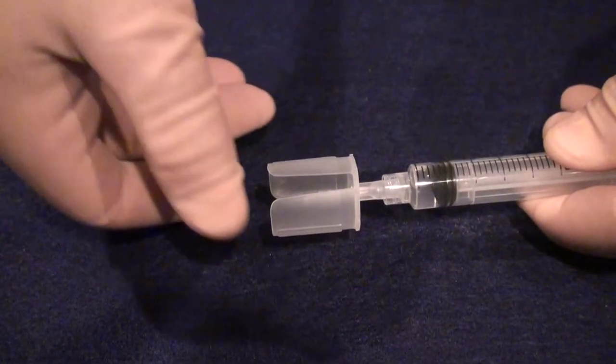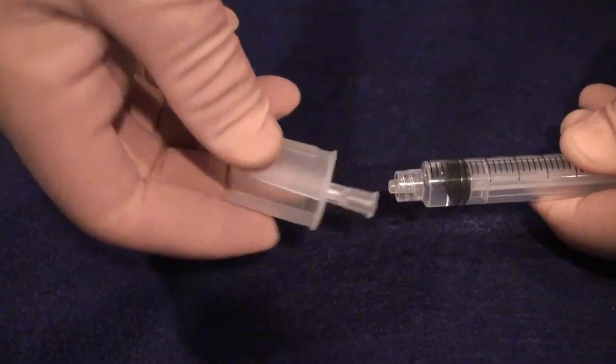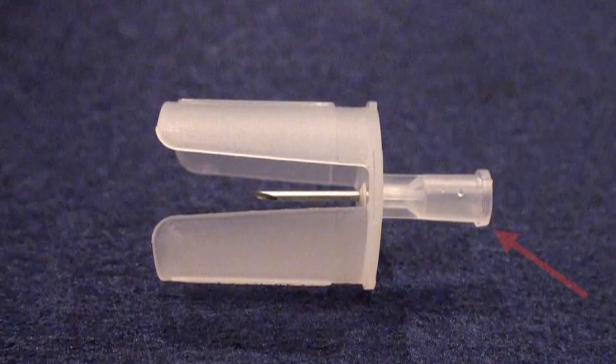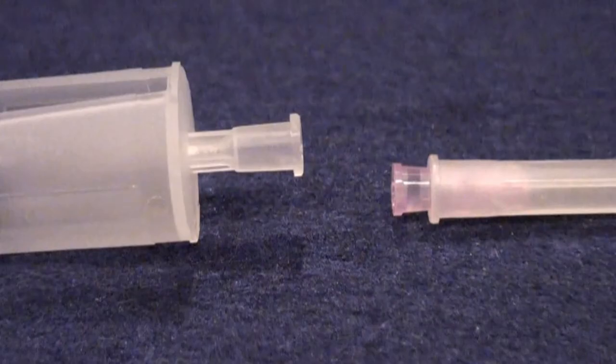Its unique ergonomic design allows it to easily be unscrewed from the syringe. MedMate's floating hub design allows the hub to remain above the surface, thus preventing contamination of the hub. Compare this to a regular needle hub, which touches the surface, thus rendering it contaminated.